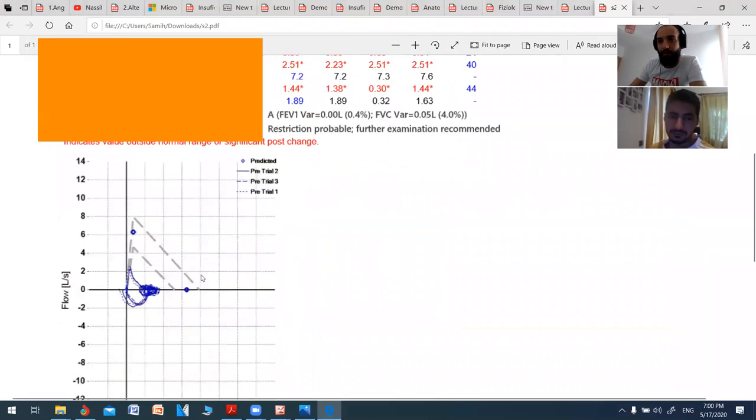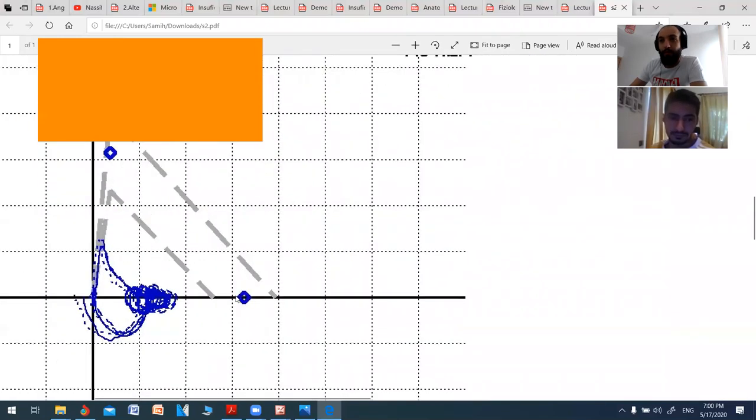What do you see here? She has a modification on volume? Yes. Also the flow. Yeah, but look, the concavity here isn't that modified. You see, it's almost normal. It's not like that one. That one was more obvious. You understand? If it was like this, it was more obvious, if it has concavity like this. The first will be, okay, I don't care. It may have mixed. Let's check.